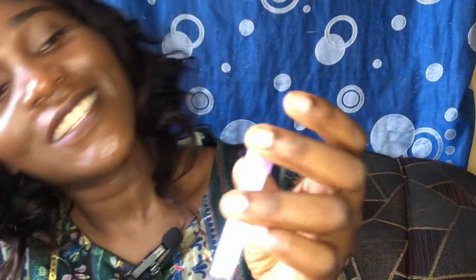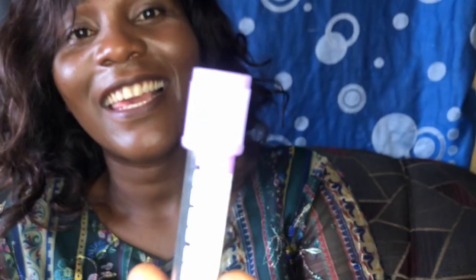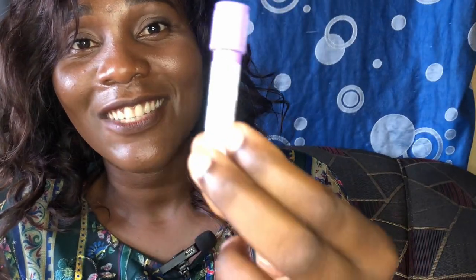So we move over to this. I believe you know this already. This is EDTA, ethylene diamine tetraacetic acid, isn't it?